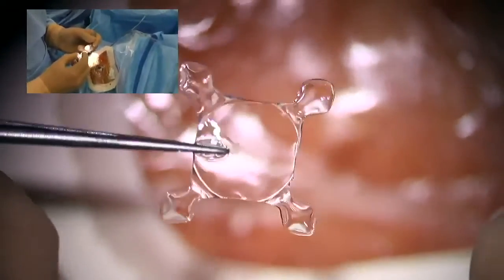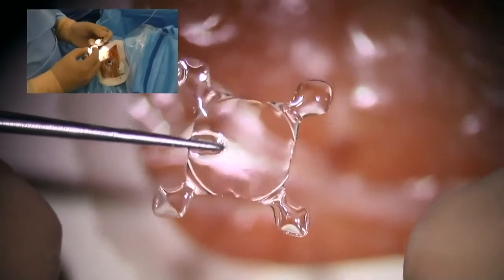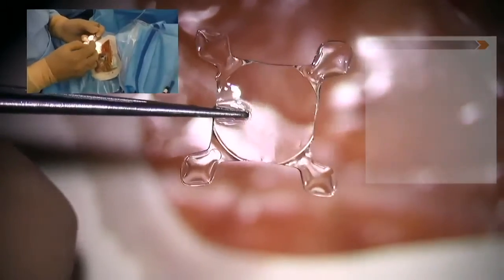So now we are at the implantation side for the add-on IOL. There was a question about the alignment and the way to avoid an upside-down implantation. I would like to show you the lens. You see here the 6-ring diffractive array probably. You see the haptics, and you see, give me the push-pull.